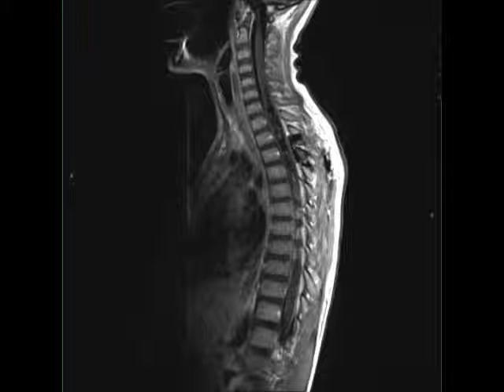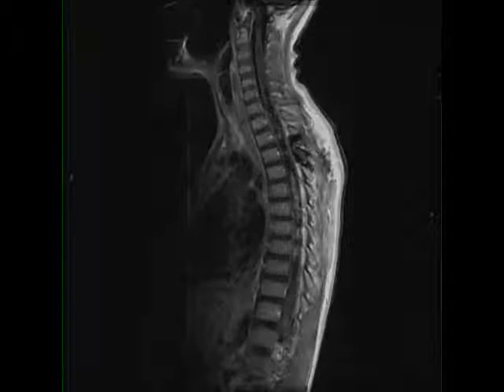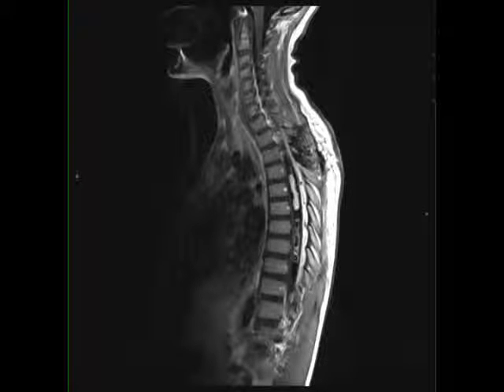This was a case of cord ependymoma. Intramedullary spinal cord ependymomas are rare, accounting for only 4% to 10% of CNS neoplasms. Spinal cord ependymomas are more common in adults, while astrocytomas are more common in children.